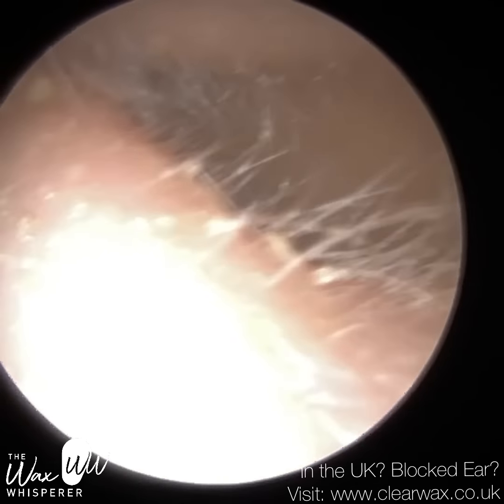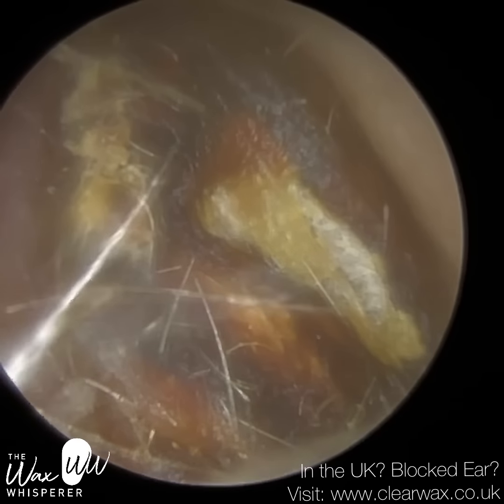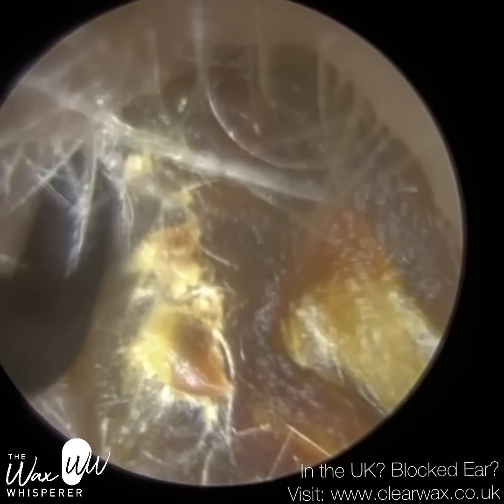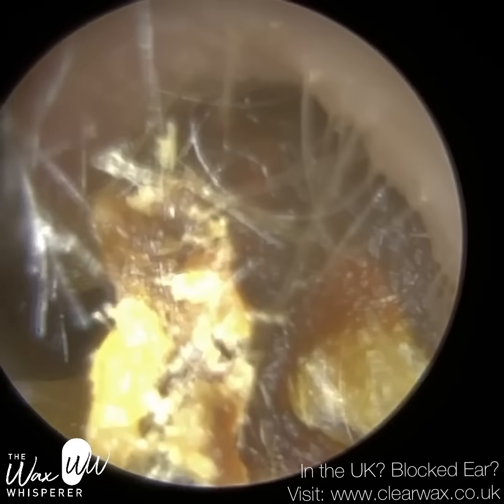So either you put drops in and let it soak for a few minutes, which is not necessary because we can quite easily use the hook. I'm going to glide it posteriorly, just maneuver the wax plug forwards a bit so I can get the hook in further.